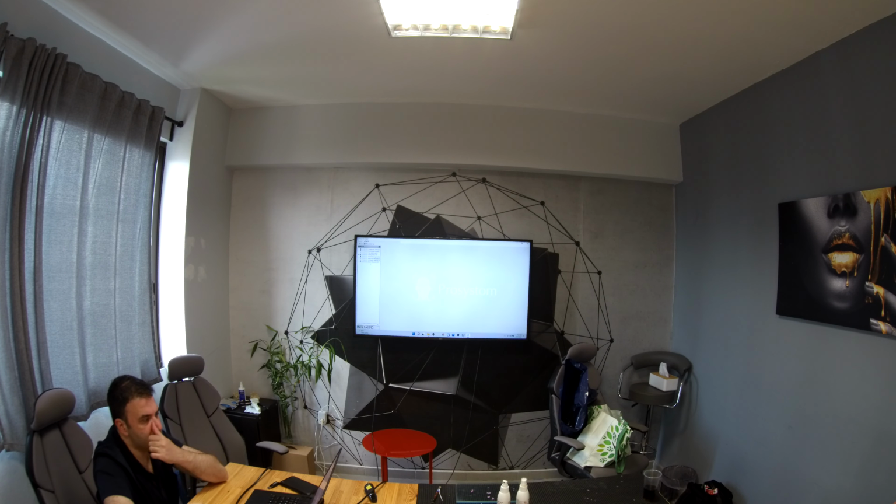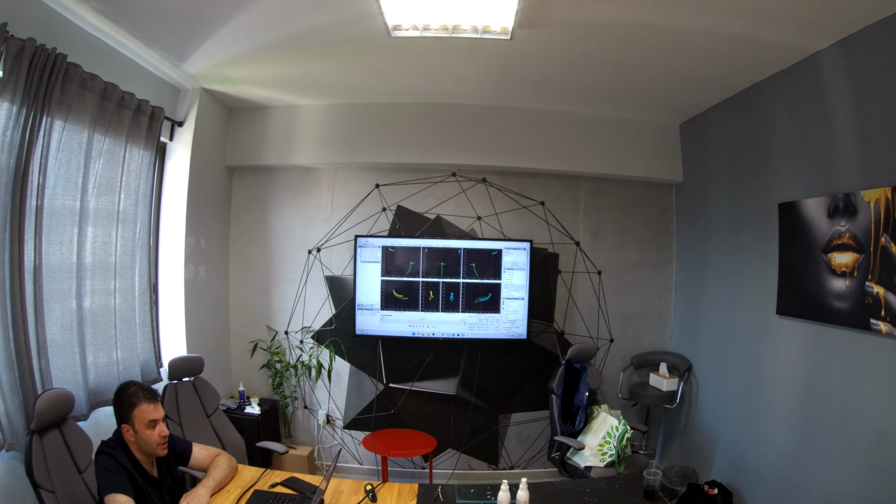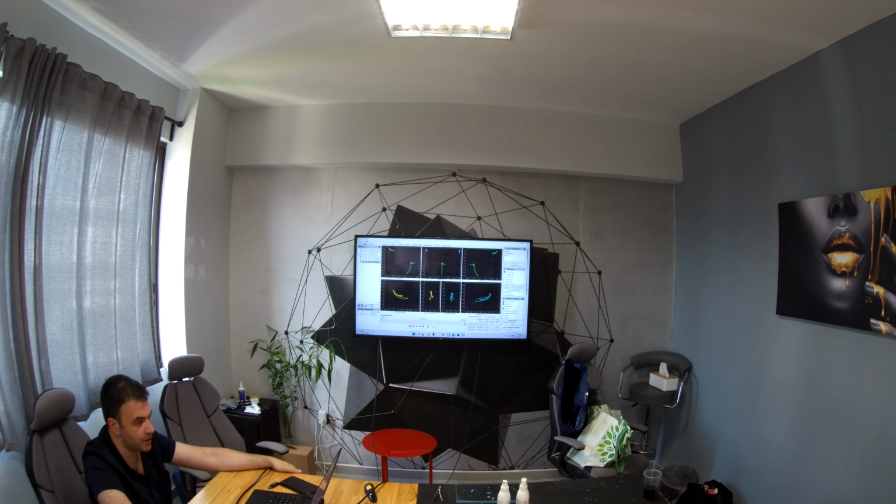So, we do axial, models, and PD. After we aligned the upper model with the fork, and aligned the upper model on the fork with the upper model that we studied before, we have the position of the upper and lower model in three axes, X, Y, Z, in horizontal, sagittal, and vertical planes. So we go to this, and right now what we have is axiography, but it's every movement that we did, these 10 or 15 tests that we performed, so it's quite confusing.